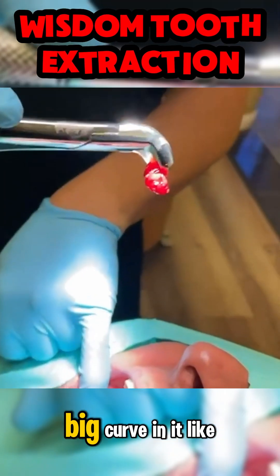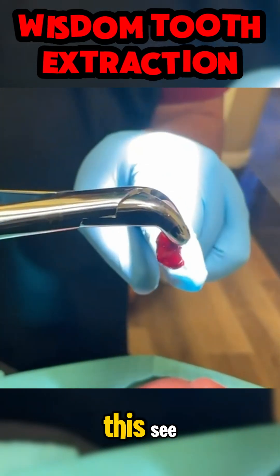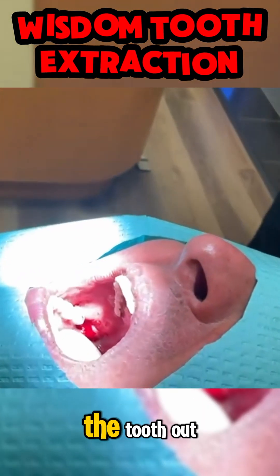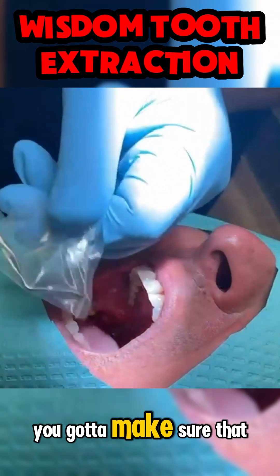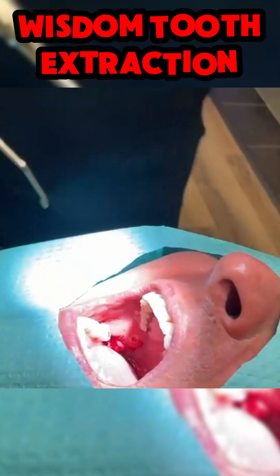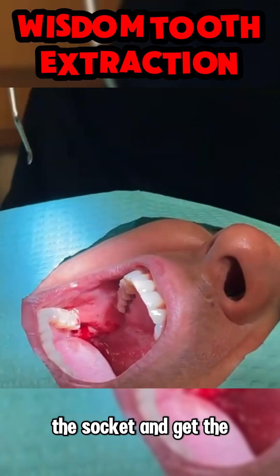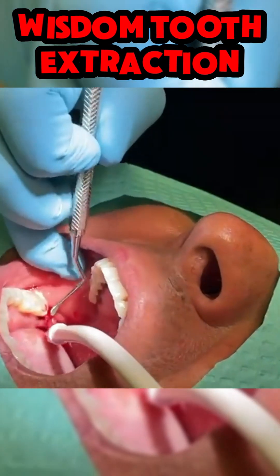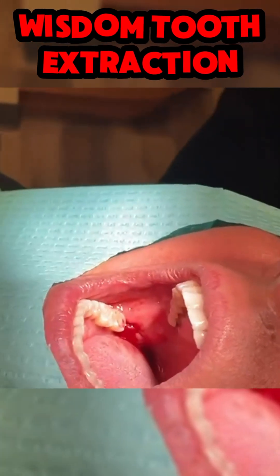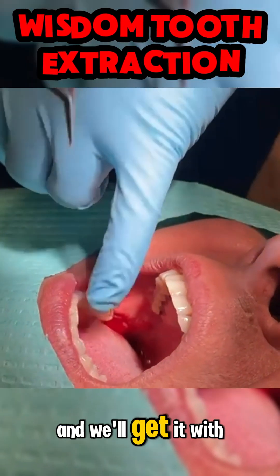It comes out with a big curve in it like this. So once you've gotten the tooth out, you've got to make sure that you clean the socket and get any infection or little piece of tissue out of there.